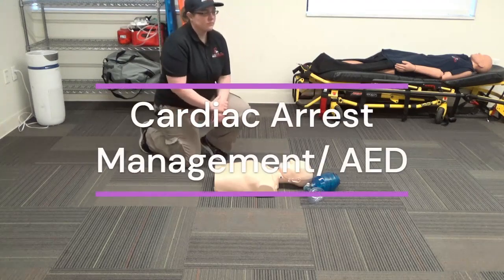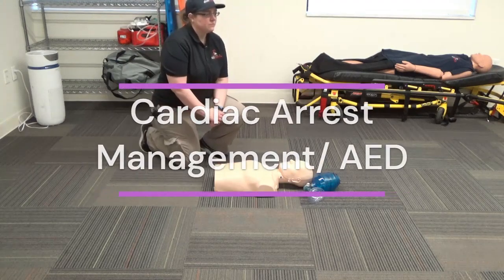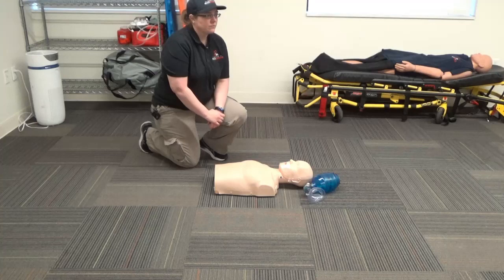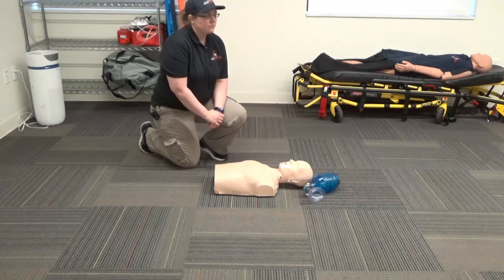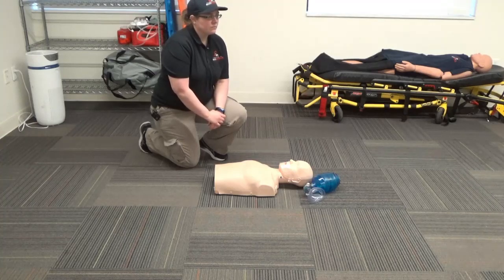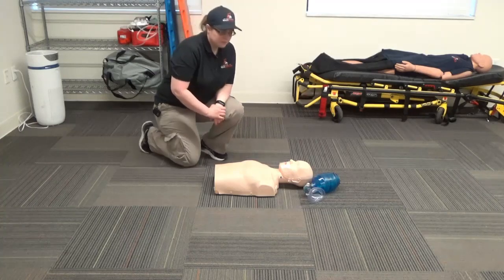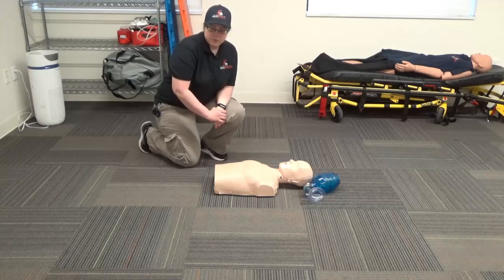This is a CPR AED station. You'll be expected to demonstrate how to run a cardiac arrest with an automatic external defibrillator. You may begin.